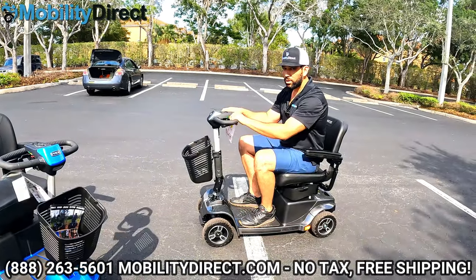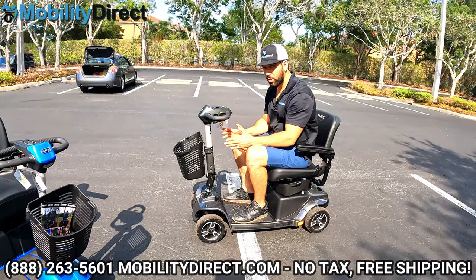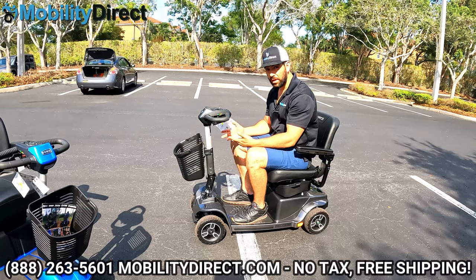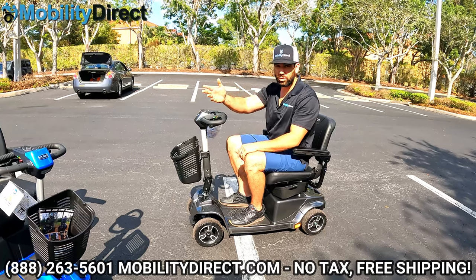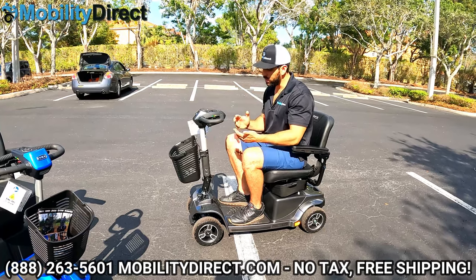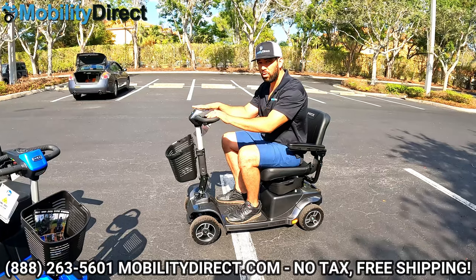With the four-wheel version, you're going to have better stability while going off-road. It's not going to turn as sharp, so if you're going to a theme park like Disney where you have to make several sharp U-turns, the three-wheel version is probably going to be better. But if you're going on grass, the four-wheel version is going to ride better and perform better.